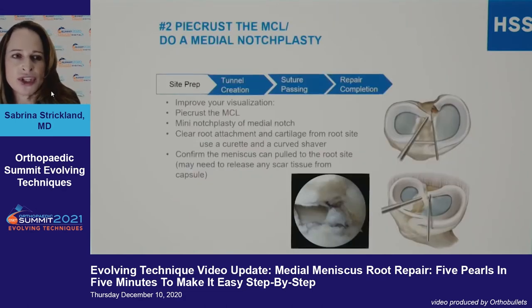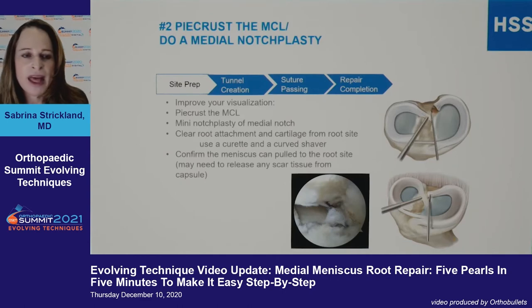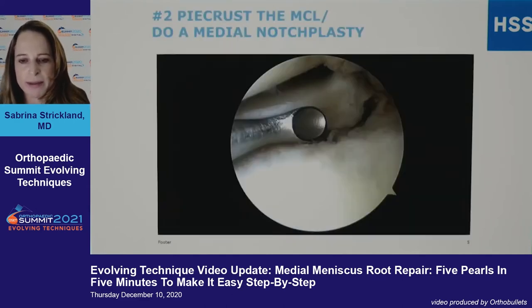Number two: I think in every case you need to piecrust the MCL. It's easy, and there's data showing it doesn't make any long-term difference. A medial notchplasty can be helpful, but most important is that you really need good visualization — the last thing you want to do is cause more damage to the knee.